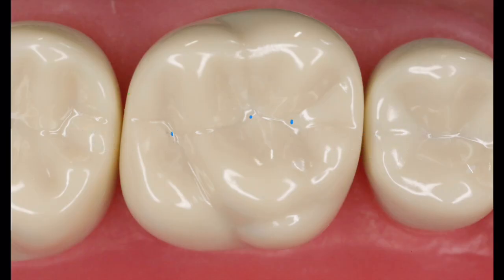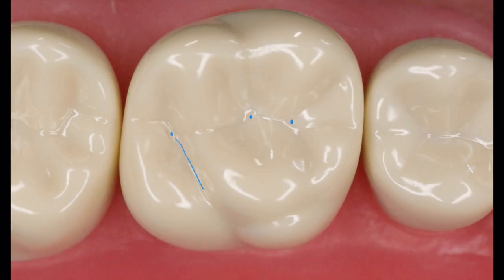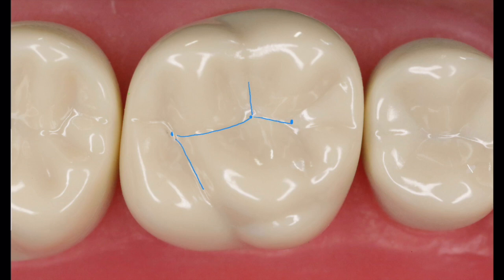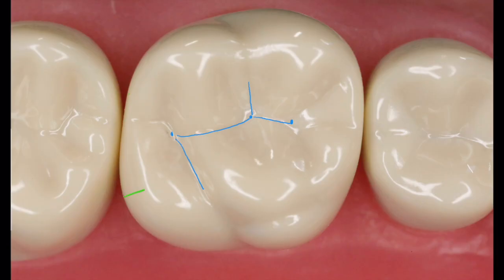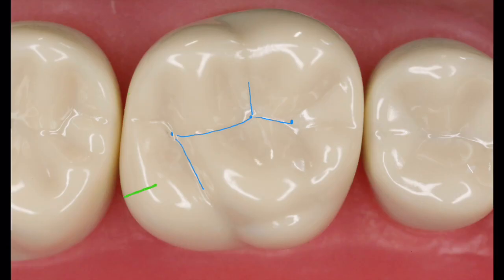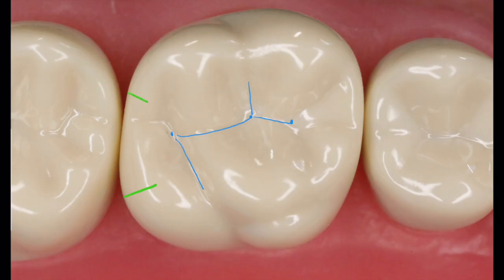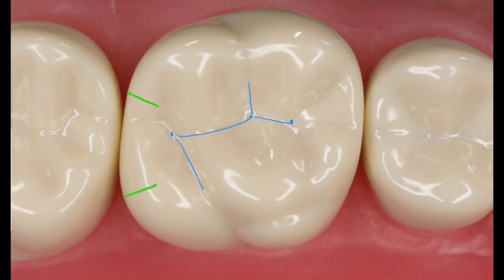Let's take a look at the primary groups here as I connect the dots between the central pit, the distal pit, and the mesial pit. You can see that if you're going to cross the oblique ridge, your outline form will be very different than if you were just going to leave the outline form on the distal portion, but both outline forms are going to have an identical shape in the distal.